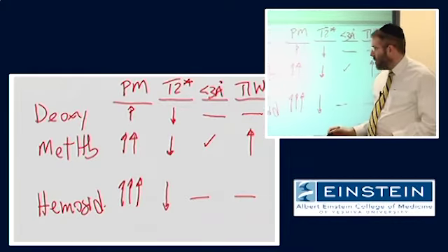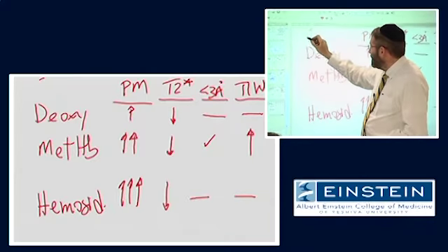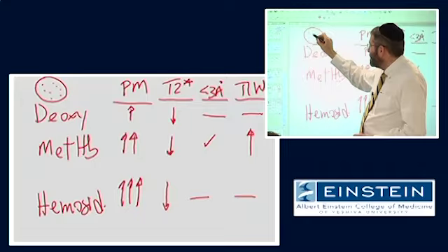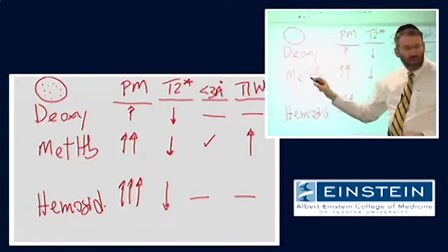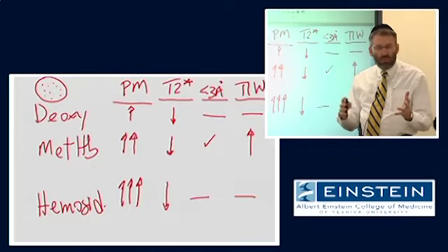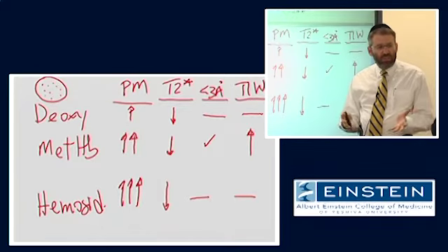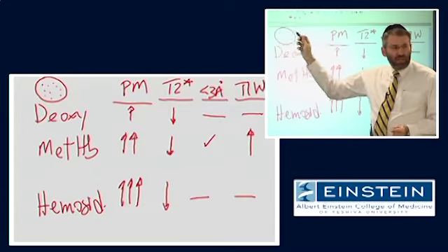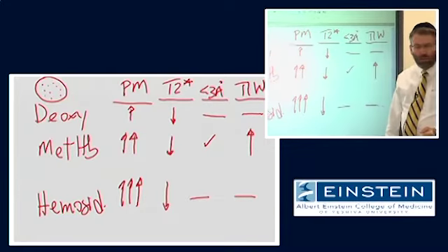So if you think about what is going on in the clot, we have localized foci containing this paramagnetic substance, intervening serum or water or whatever it is, which is essentially diamagnetic. So there are dramatic gradients of magnetic susceptibility.